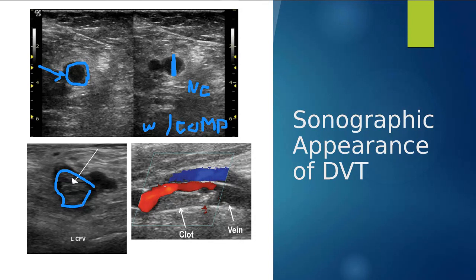Every place has a slightly different protocol, but we need to make that clear with our annotation on the picture. The more obvious clot on the bottom: the transverse picture pretty much gives it away, and when you turn to sagittal you can see the whole clot extending for distance in that vein with only a little bit of blood flow traveling through.